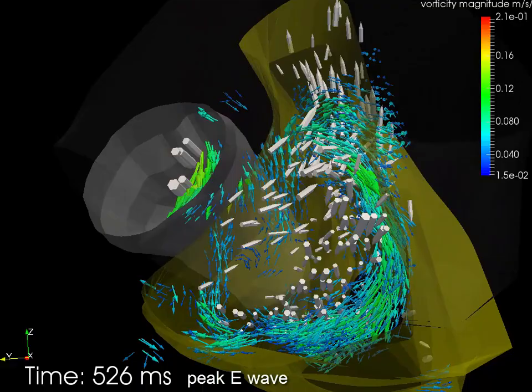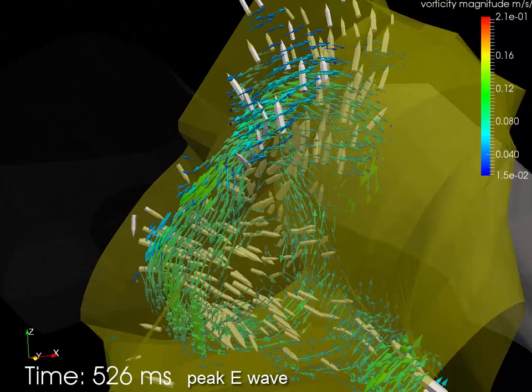However, a lot of this vorticity is actually on the leaflets of the tricuspid valve between the atrium and the ventricle.